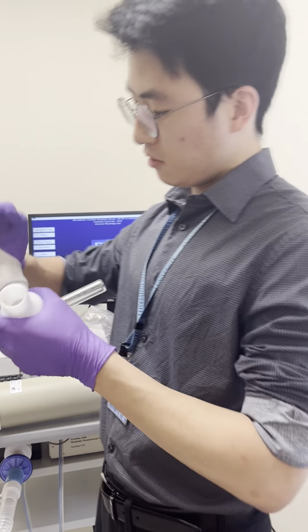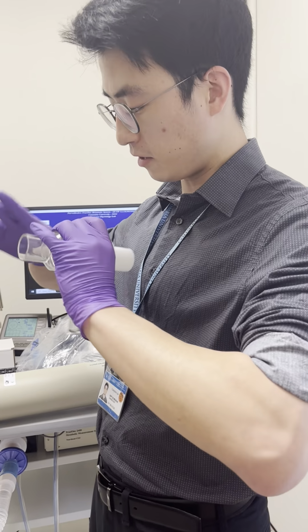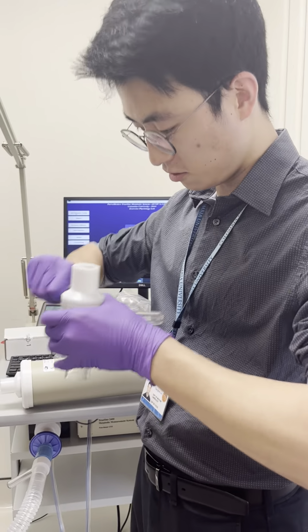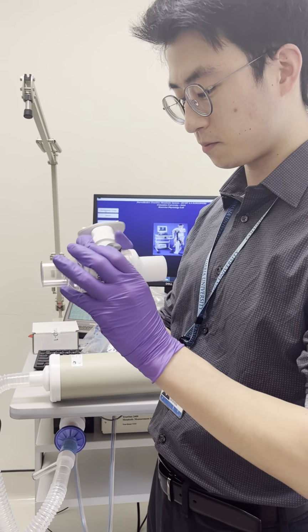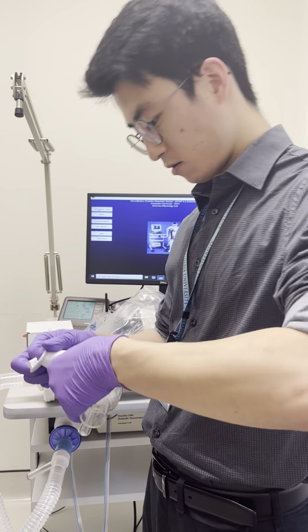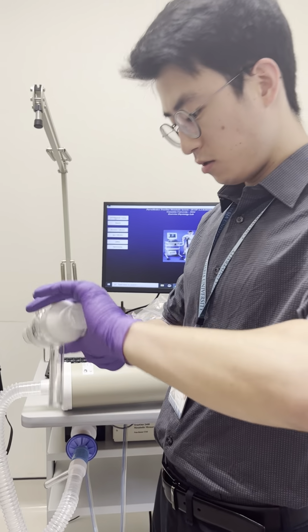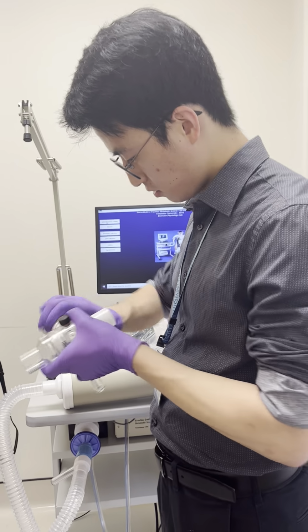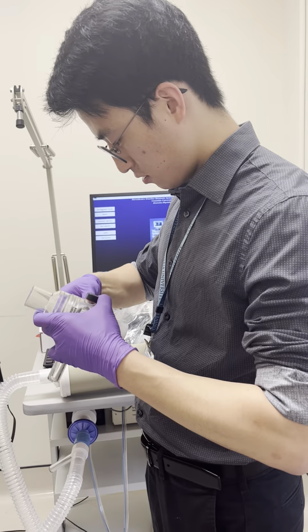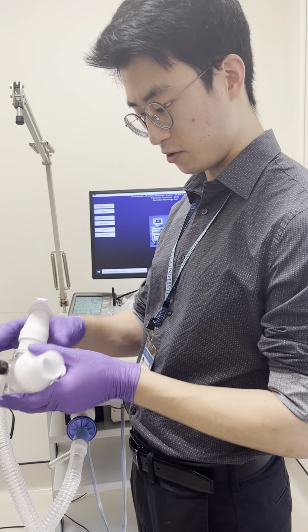I just tried this yesterday, and I think it works best if you stick a hand in there, just a thumb in there, and mash it in like that. And then make sure that it's straight, and I guess this doesn't rotate very much.